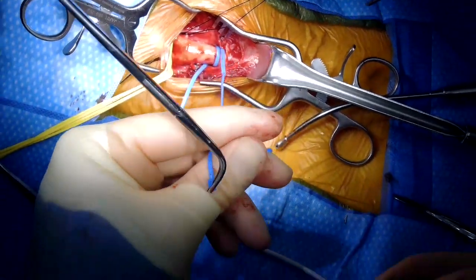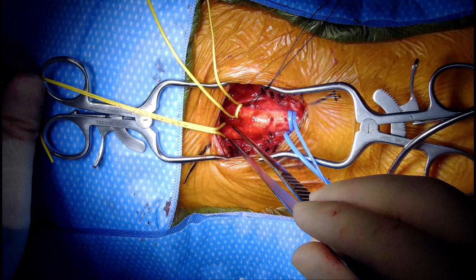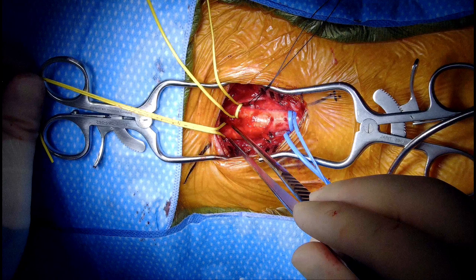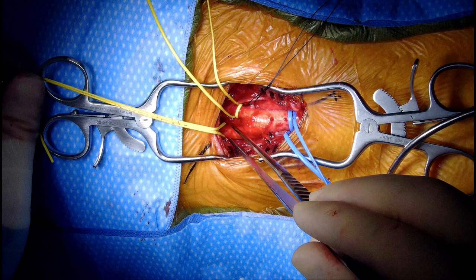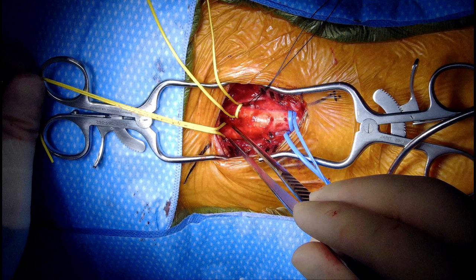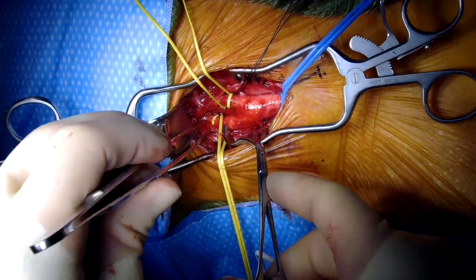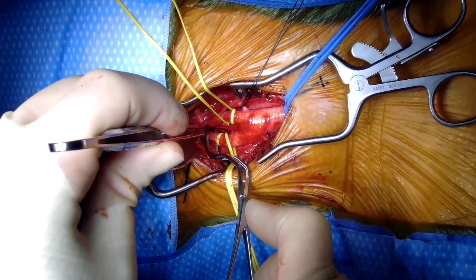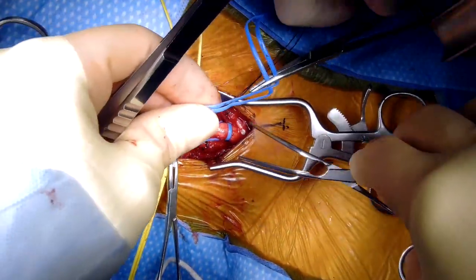At this point, the patient was prepared for carotid clamping. His blood pressure was increased with a systolic blood pressure greater than 130 and he was noted to be normocardic. There had been no bradycardia noted with dissection around the carotid bifurcation and atropine was not necessary. The patient was systemically heparinized with 100 units per kilogram of IV heparin and an activated clotting time was sent and found to be greater than 300. After allowing the heparin to circulate, the internal carotid, common carotid, and external carotid arteries were clamped in that respective order.